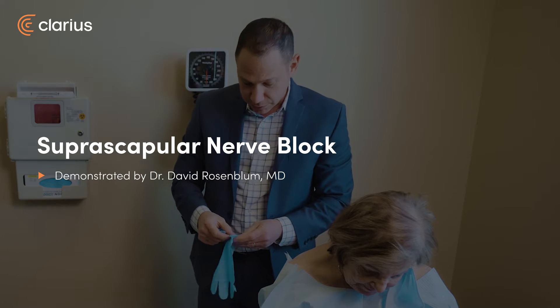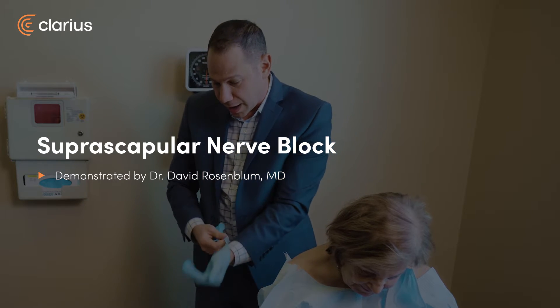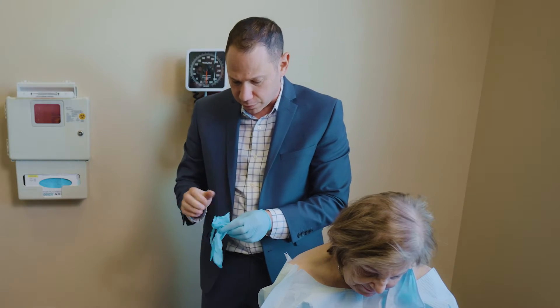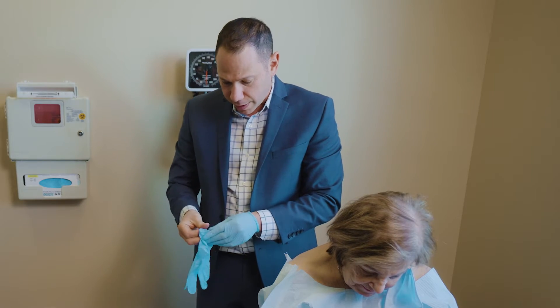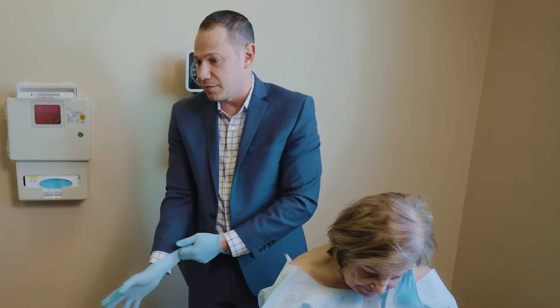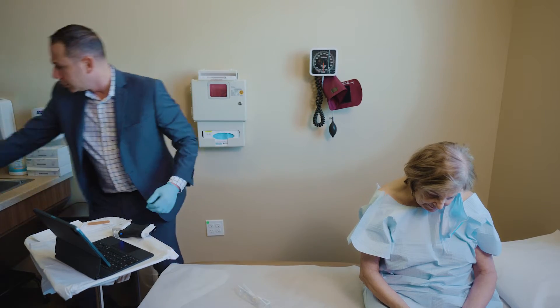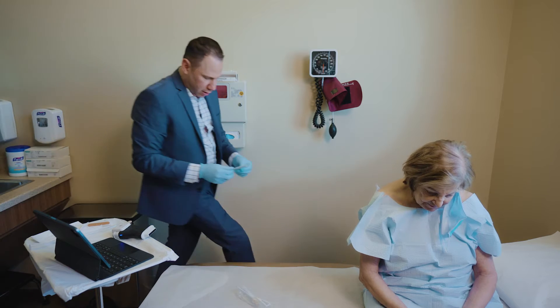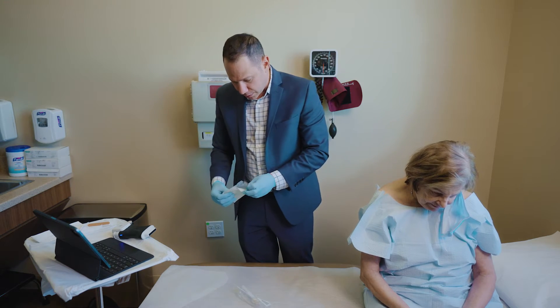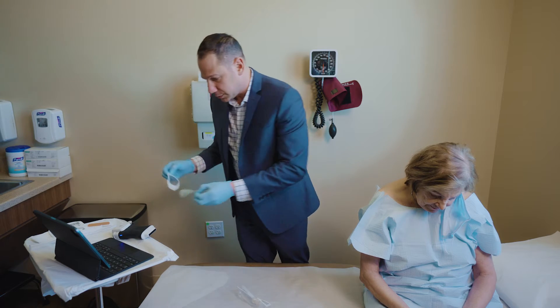This is Hoda. Hoda presents with pain in the neck as well as bilateral shoulder pain. Imaging is positive for arthritis of the shoulder as well as multi-level cervical degenerative disc disease. Today I'm going to perform a suprascapular nerve block on her bilaterally, scan some of the anatomy, and hopefully alleviate her symptoms.